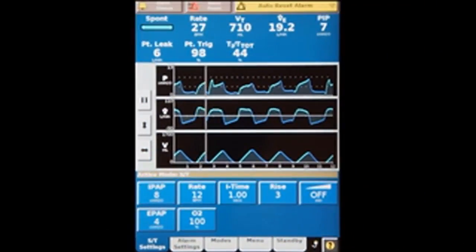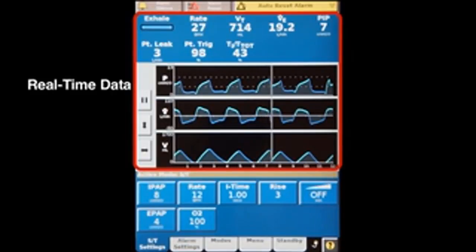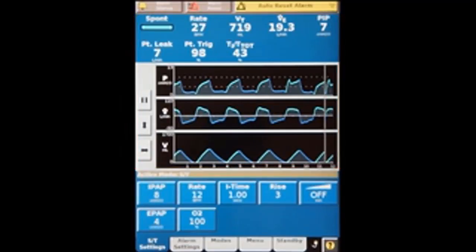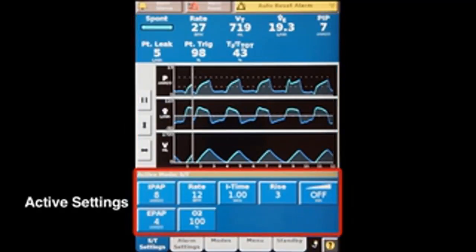This standard ventilator display has two main panels. A top panel conveys real-time information about the patient's breathing in both numeric and graphic formats, while a bottom panel displays the active settings.